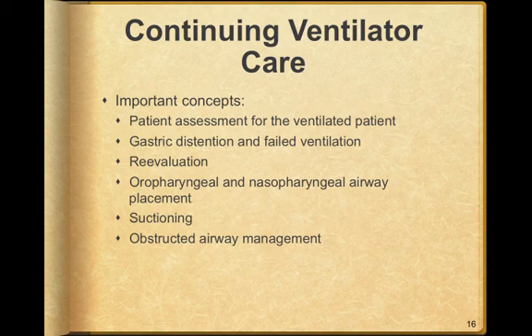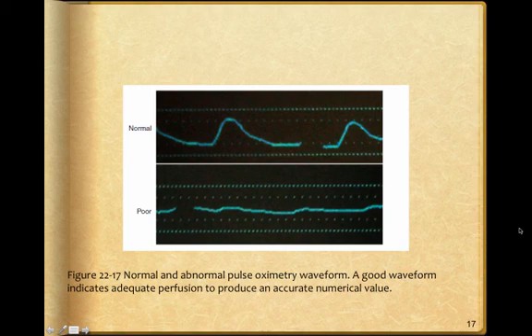If the patient still cannot be ventilated after suctioning, repositioning, and obstructed airway skills have been applied, the patient must be transported rapidly. And again, this is in BLS mode, or basic airway management techniques. If you have the ability to bridge to ALS, then you should facilitate airway management under laryngoscopy. A nice set of Magill forceps and a suction unit should probably be able to remove anything that is seen in the glottic opening.